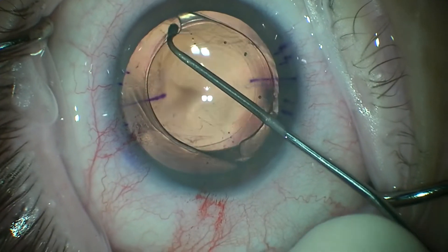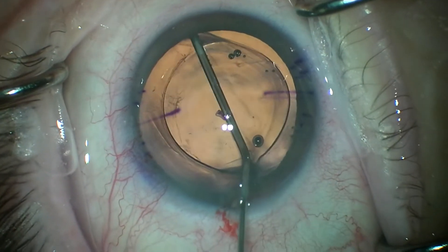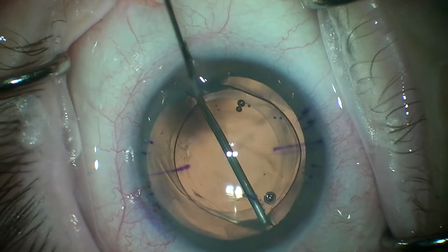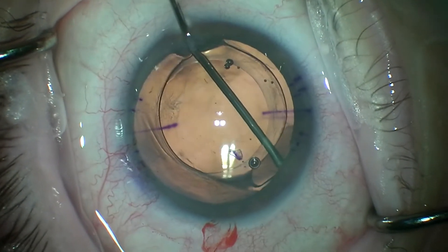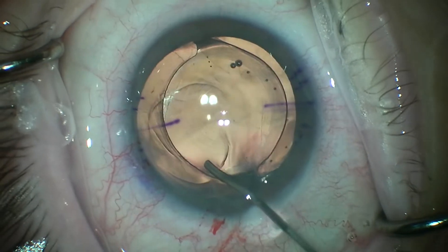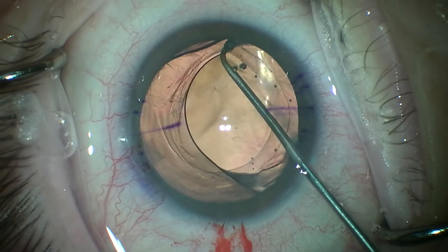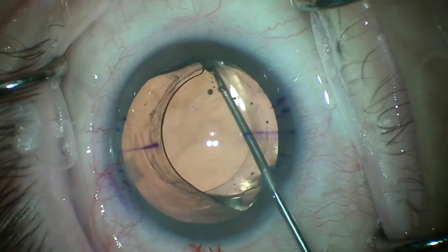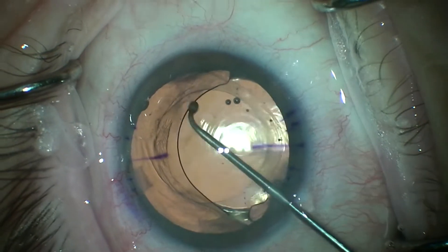The haptic at the top of your screen frees up relatively easily. It didn't quite go at first, so I just decided to push a little bit more viscoelastic around it. This is a Toric Panoptix, and if you look closely, the markings that I have on the eye are for the correct axis — versus where it's currently aligned, which is 80 degrees incorrectly.